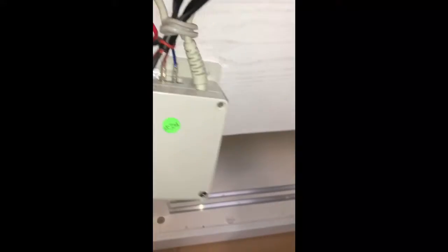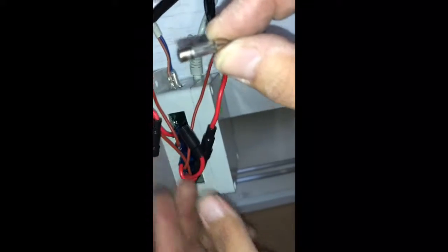Once you trace down that wire that comes all the way from the top till here, you're gonna trace it, and once it's traced, it's gonna be this cable right over here. This one right over here. So what we're gonna do is we're gonna check for the fuse. So we're gonna go ahead and open it up like this, and there's gonna be a fuse inside of there. So we're gonna take a look.